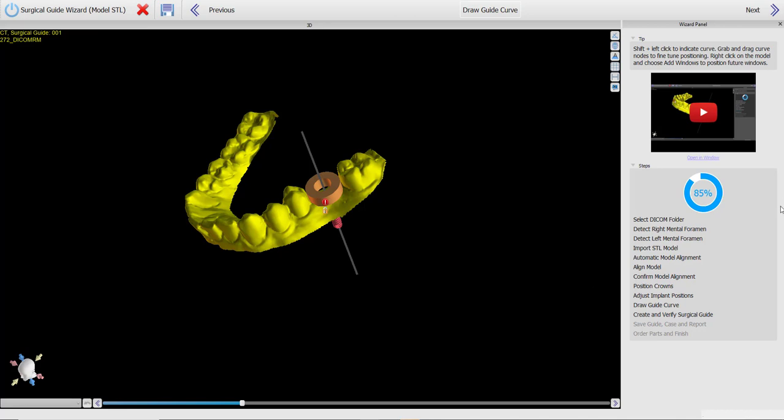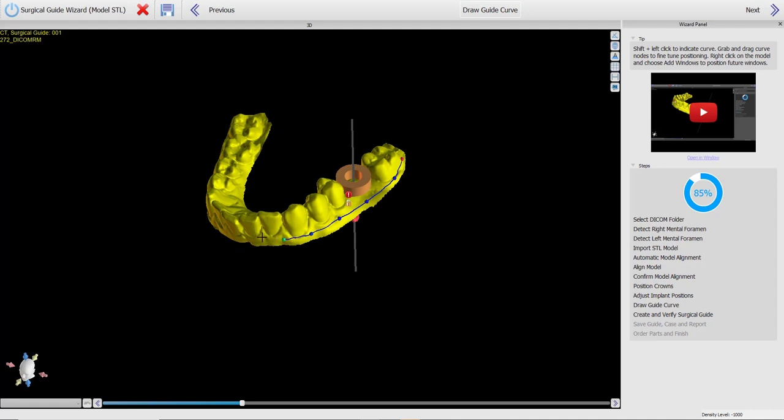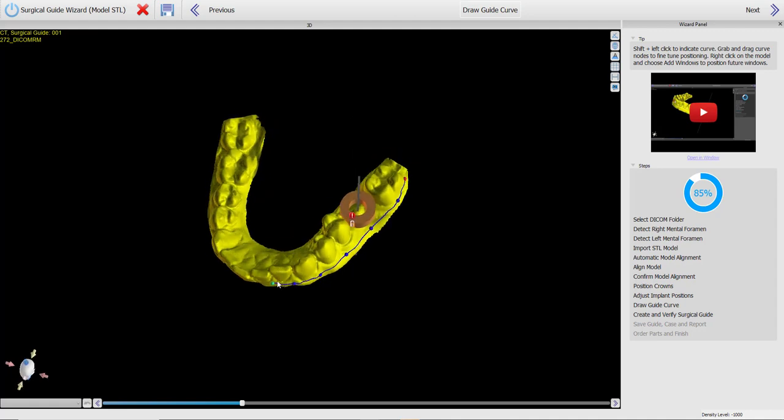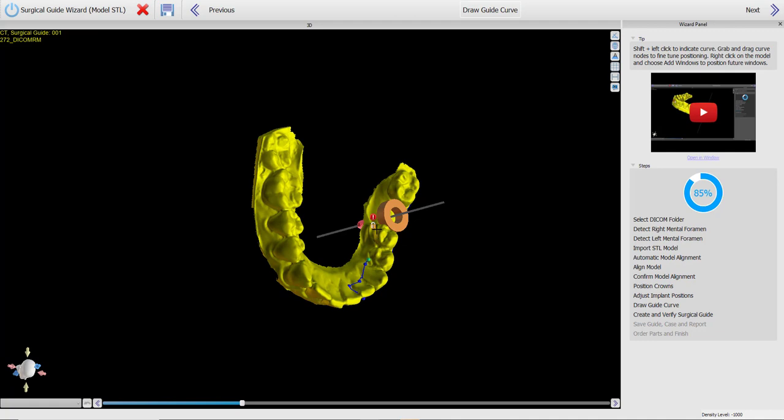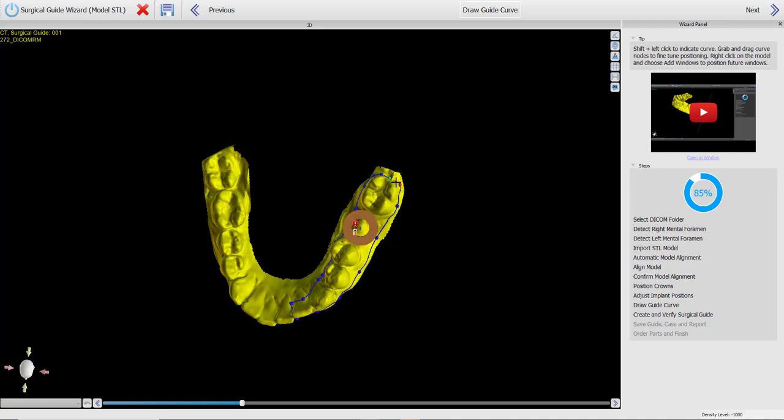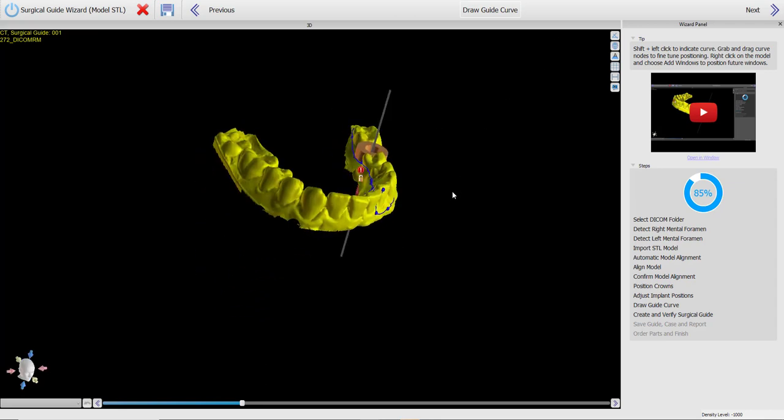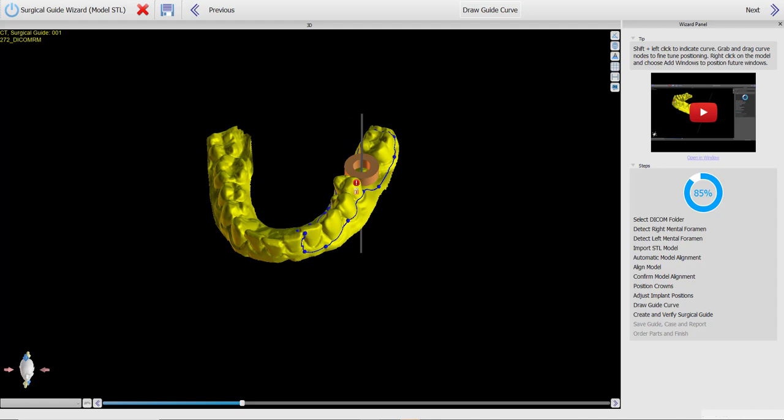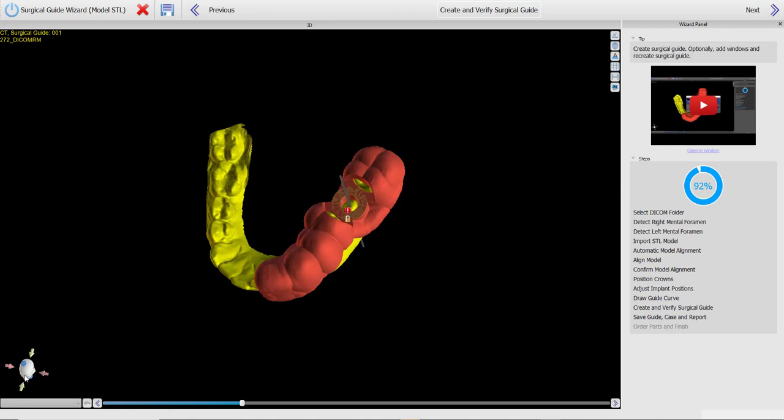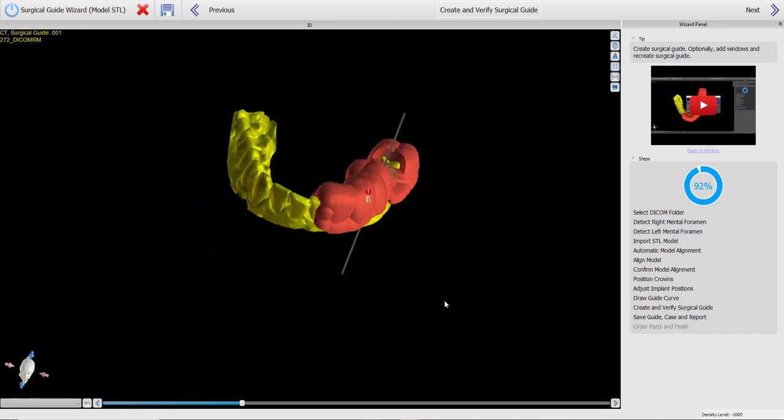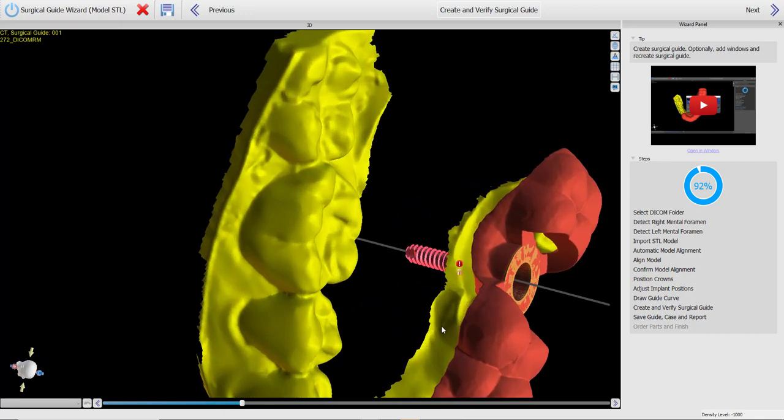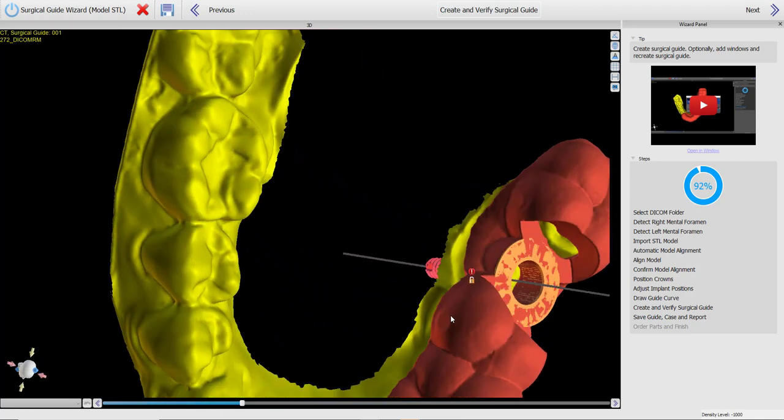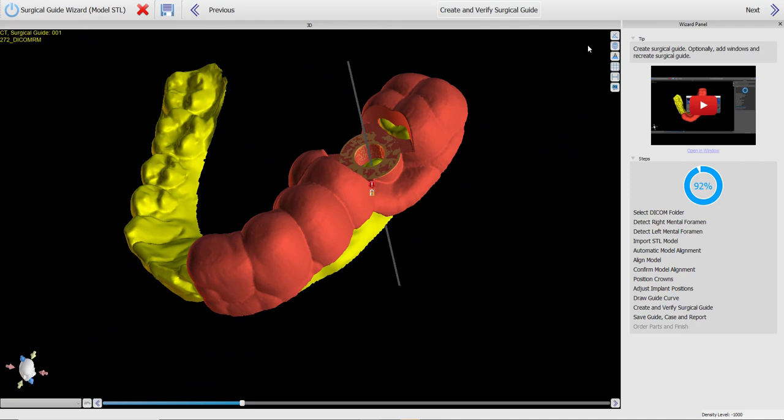So let me demonstrate how the functionality has been updated. We are now in the wizard. I'm going to create the surgical guide curve. Again, this is the original model that was merged with the CT scan. Okay, we now have our surgical guide curve. I'm going to click Next. And the result that we see on the screen now is our original model with our surgical guide placed and undercuts have automatically been removed.